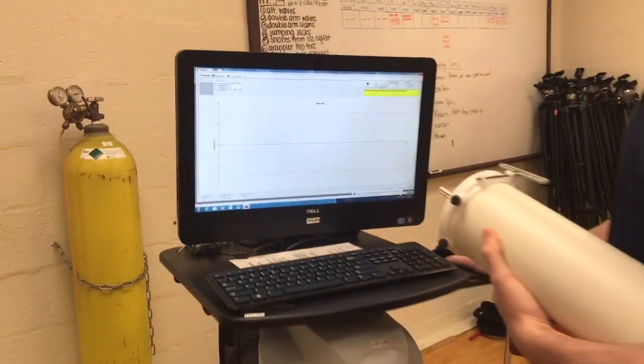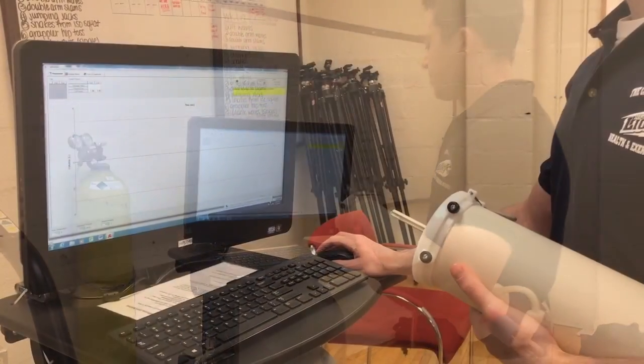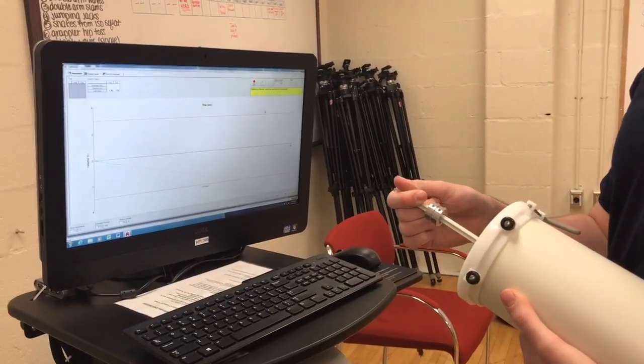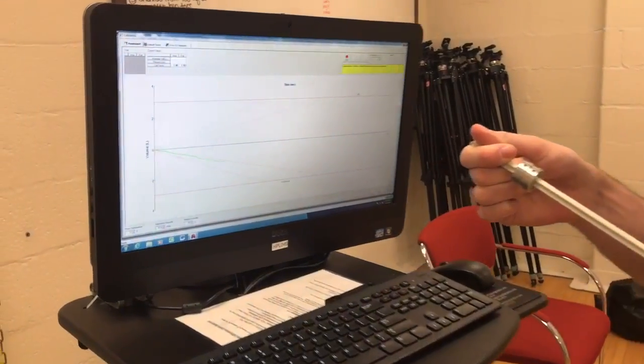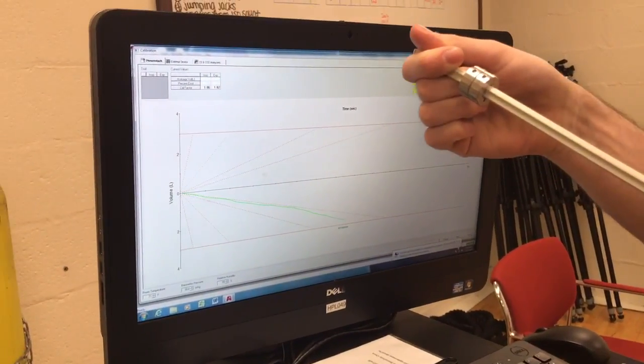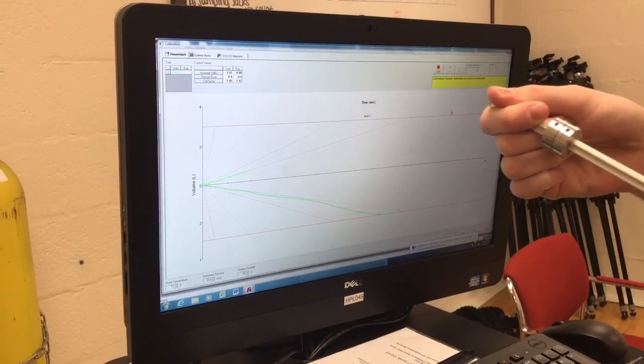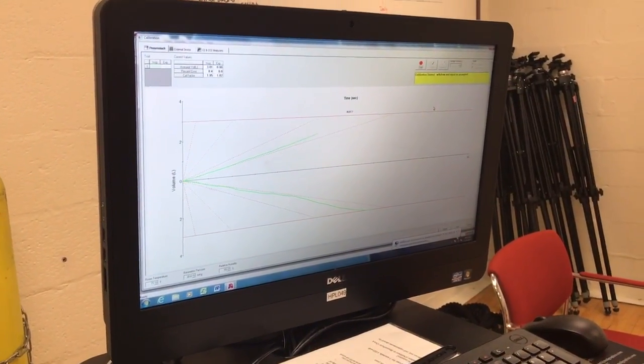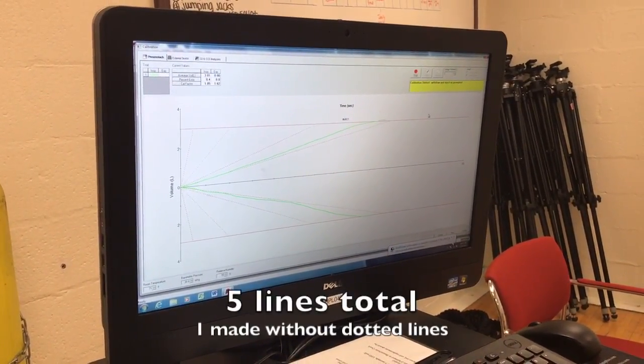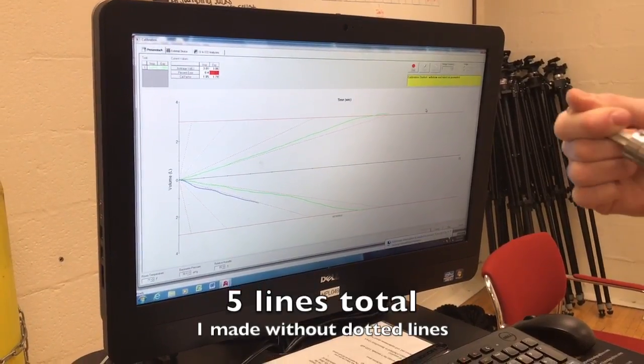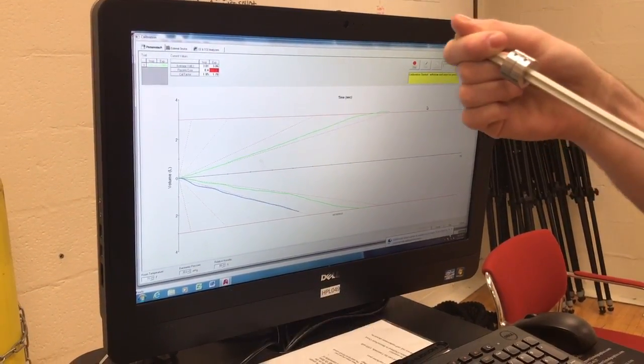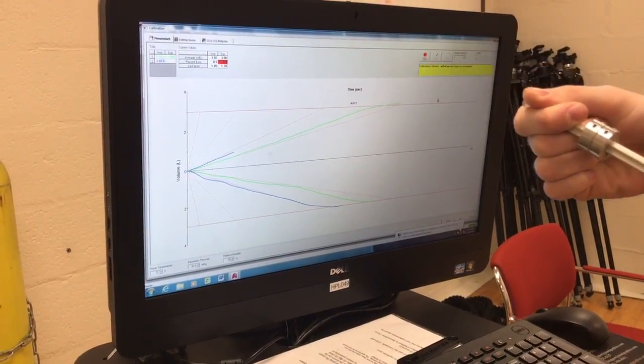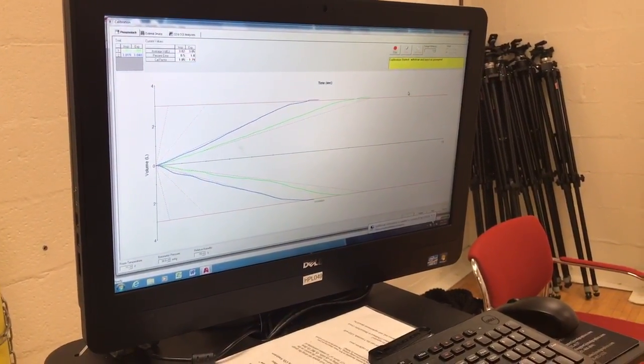Now you're going to withdraw and inject air at different speeds with the syringe. The dotted lines serve as the guideline for different withdrawal and injection speeds. It's not as important to follow the dotted lines as to just reach the top and bottom lines respectively. It's important that you don't overshoot or undershoot.